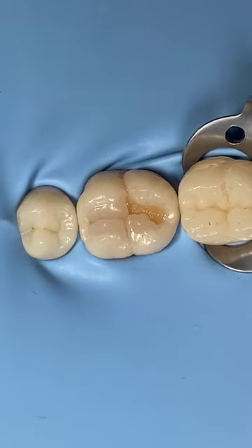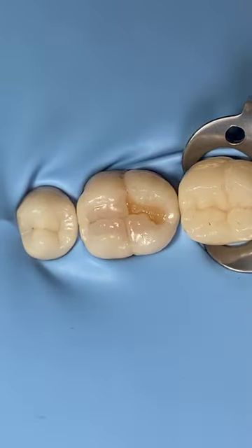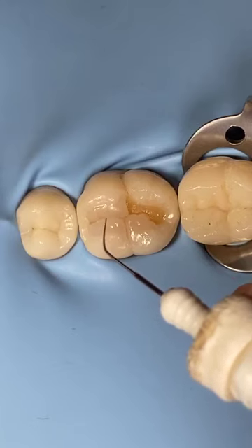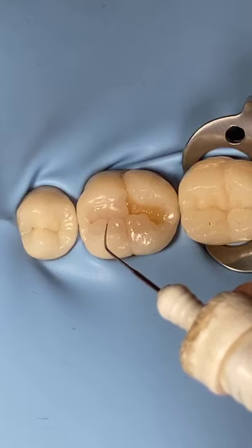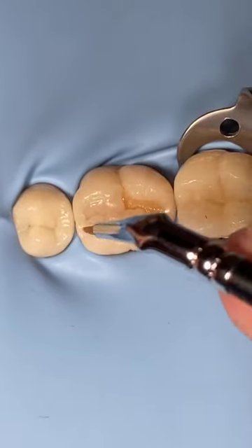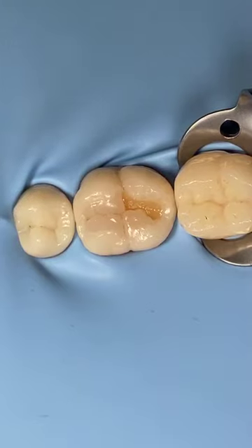How about the secondary anatomy? I think you can easily create secondary anatomy. You want me to put secondary anatomy? Okay, I will try it. But it's even easier because I only look in the camera. So same technique, you only have to do separation like this. See? And make it close to each other. Okay, the idea is the same. I think I destroyed my anatomy.